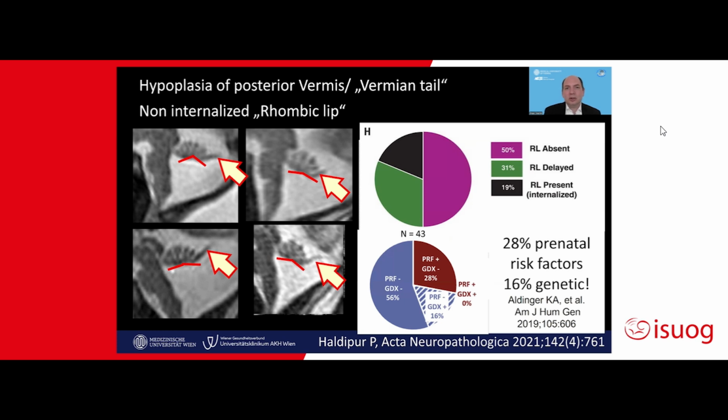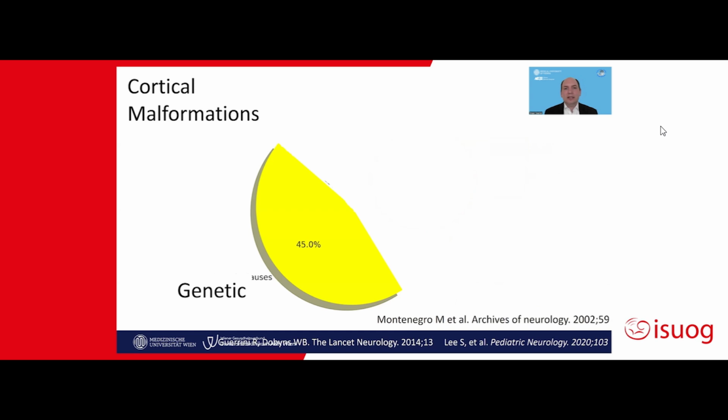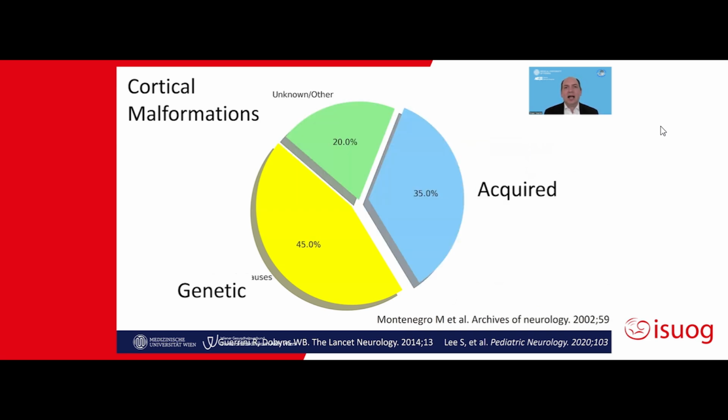And this is for me a strong case that we have to be aware that currently still the minority of cerebral pathologies is genetic. The larger part is either unknown or has also an epigenetic acquired background. The only way currently to address this properly is by an accurate phenotyping examination. You can use ultrasound for that, but if you would like to see the entire spectrum of all properties, remember the galaxies I showed in the beginning? It's probably a wise thing to also use MRI.